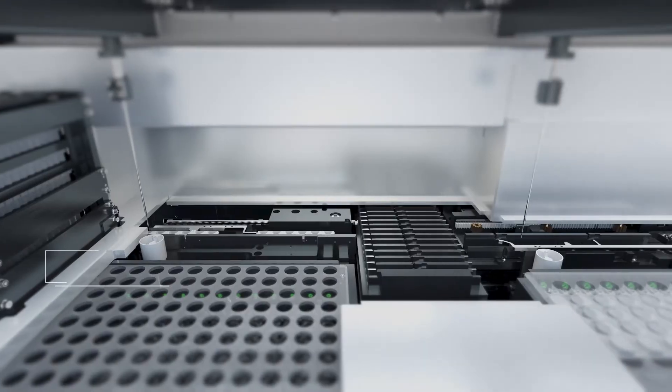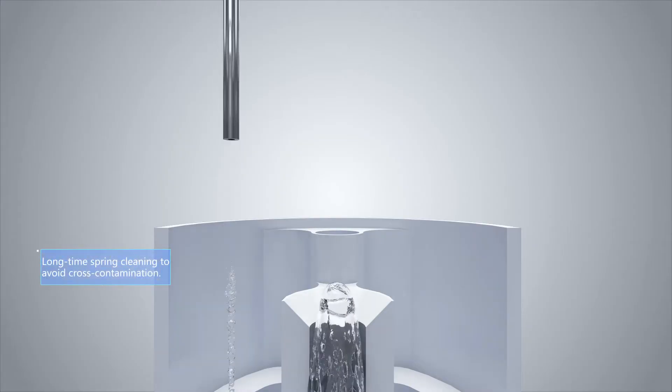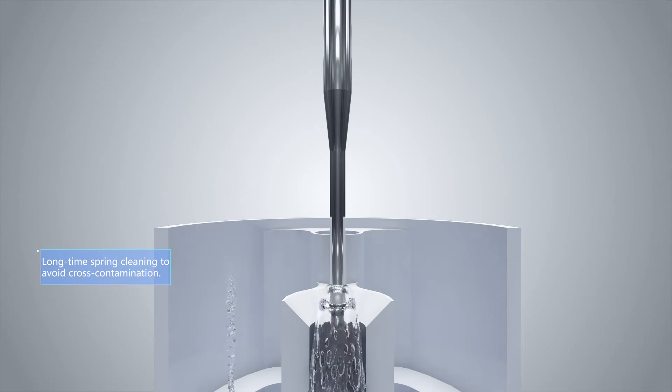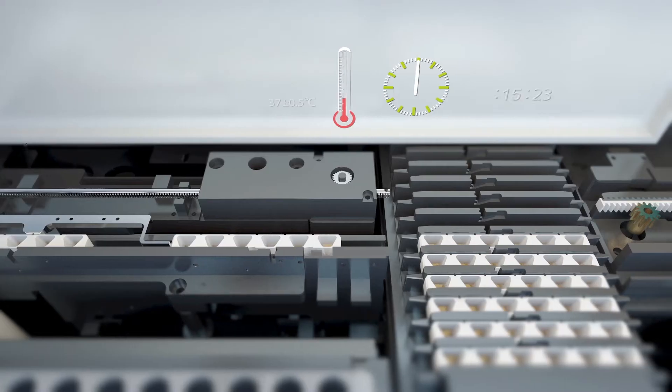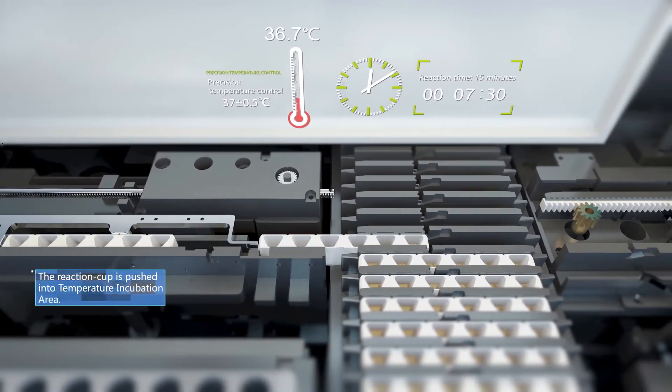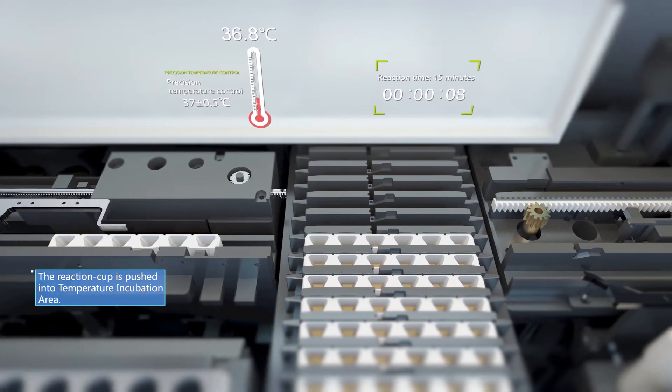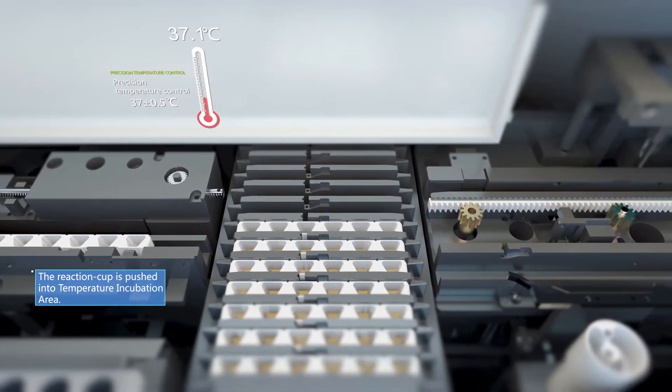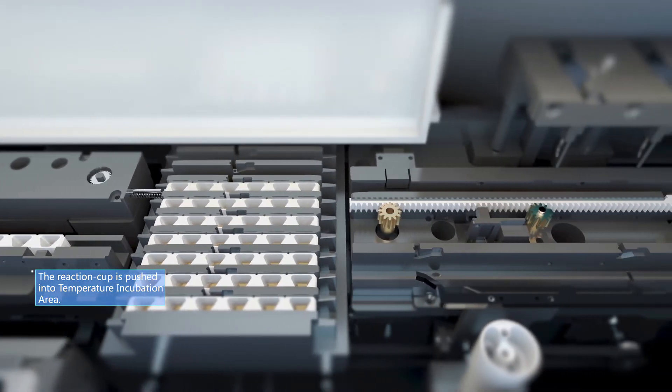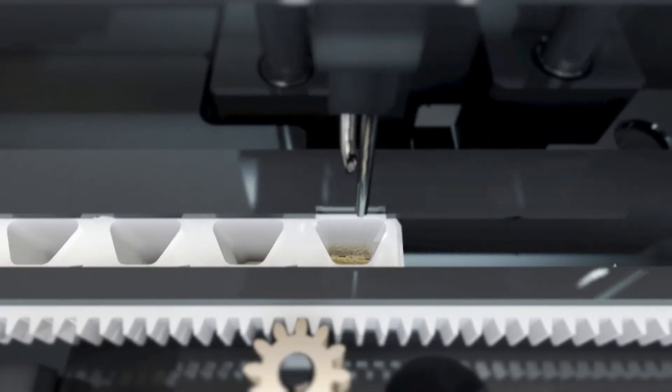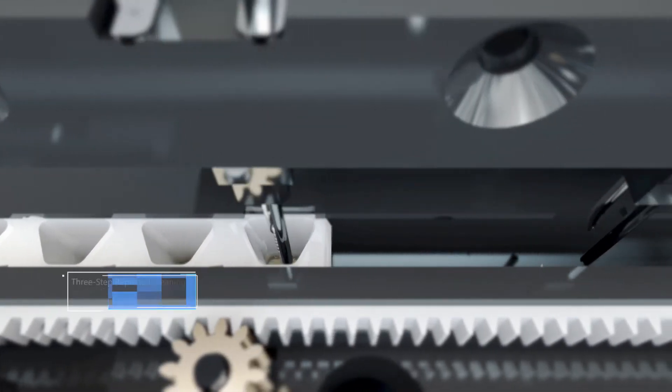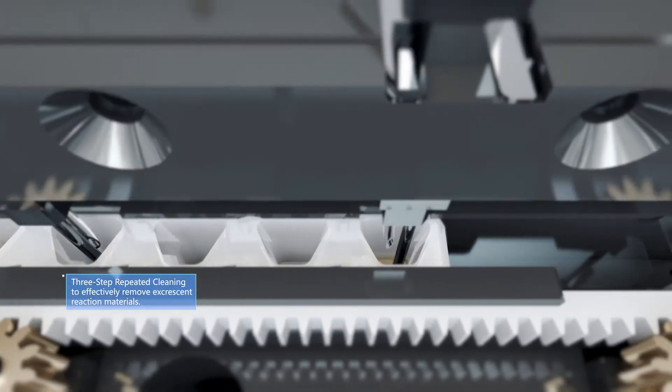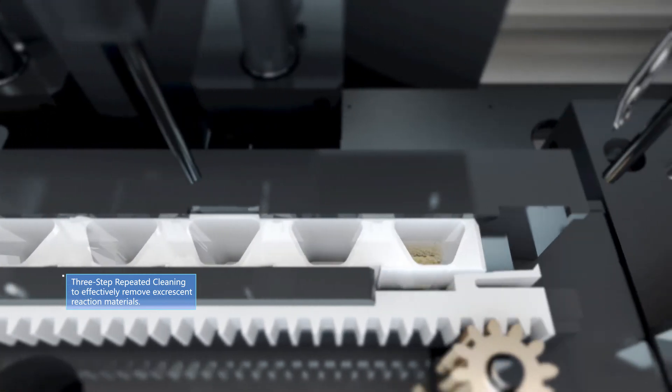Prolonged syringe cleaning to avoid cross-contamination. Precise incubation temperature control at the range of 37 ± 0.5°C to guarantee the best reaction temperature. Pre-step repeated cleaning to effectively remove excess reaction materials.